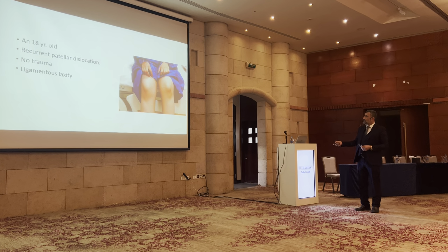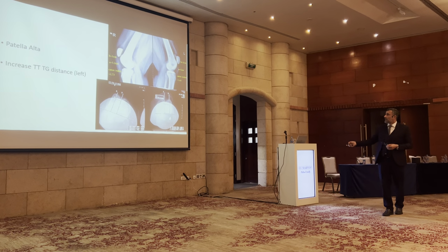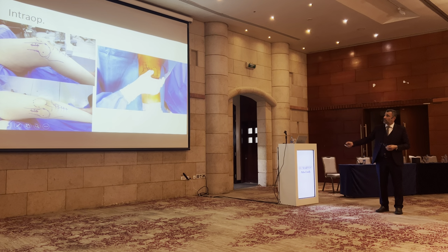Here is another patient: patella alta, subluxation, dislocation, recurrent many times. She has this valgus alignment. Again, high TT-TG distance, patella alta. And what we did, look, it's unstable before the operation. This is the incision for the osteotomy. This is for the tibial tubercle transfer.